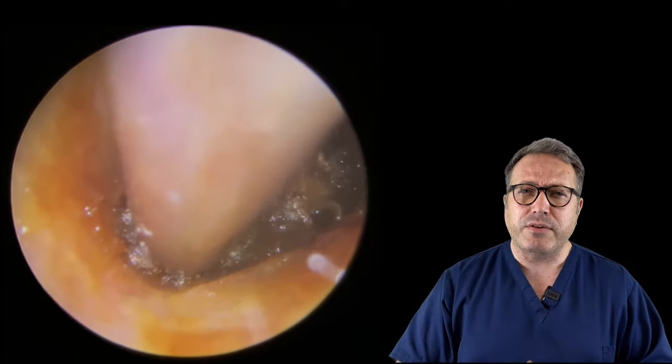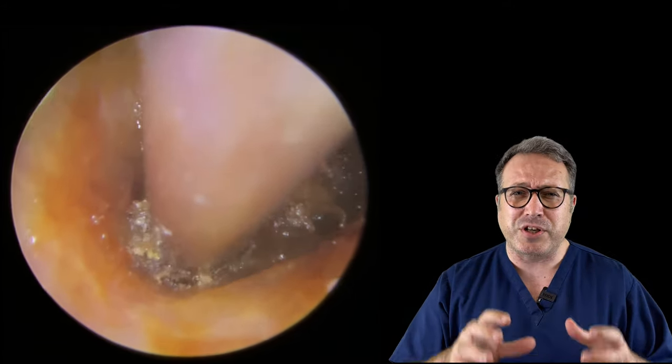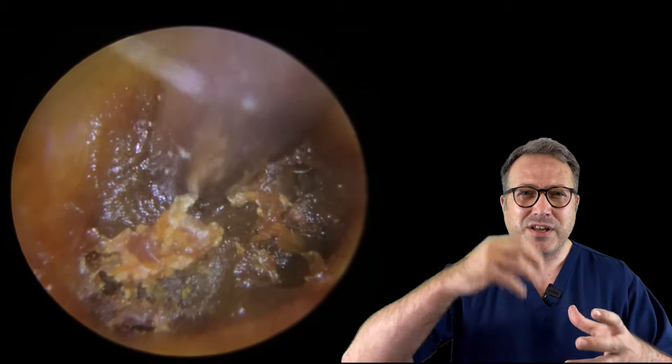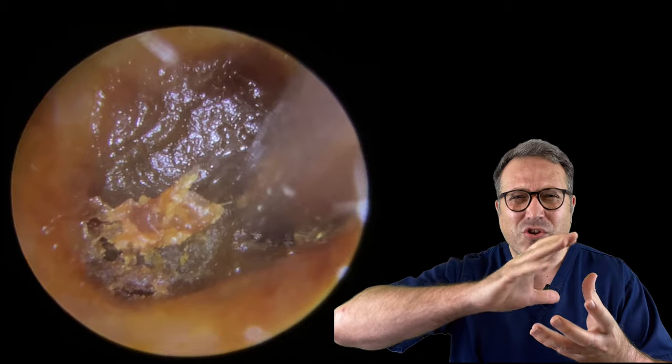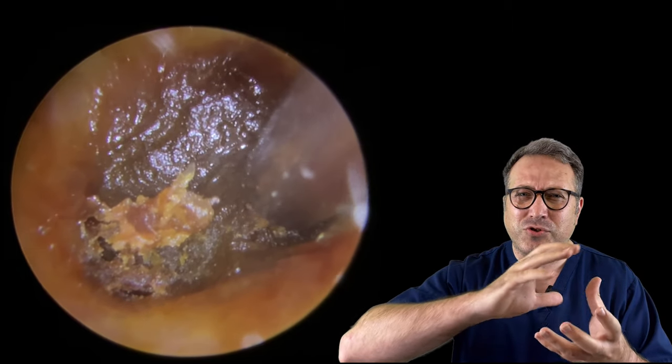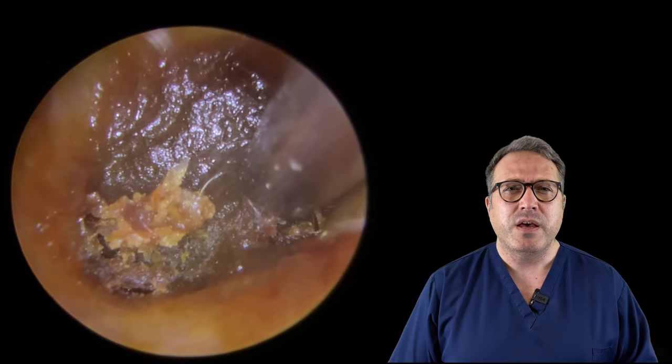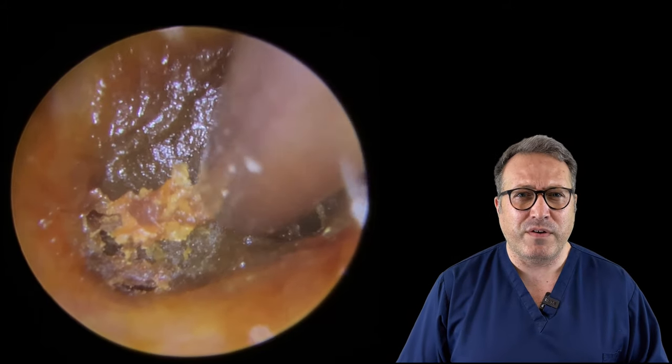What you can see here is that it's really just not budging - it's really tough old stuff. So the first lot of olive oil we've put in is just going to start to soften the outside edge, just trying to get those more porous parts of the wax to absorb that little bit of oil and loosen up, so it makes it a lot safer to take away from the patient.